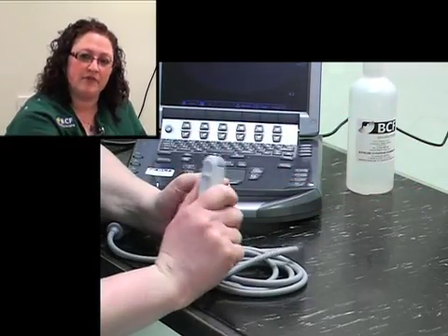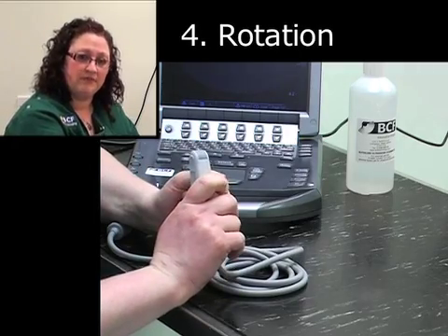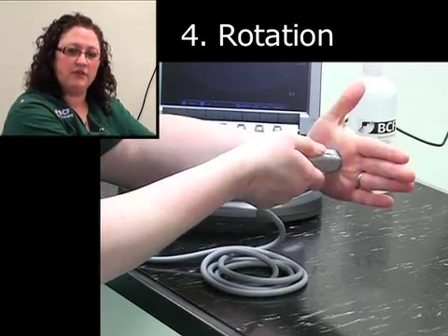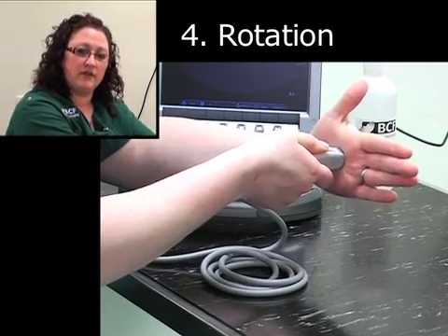A fourth movement that you can do is rotation. This is placing the probe on the surface and rotating 90 degrees clockwise or anti-clockwise.